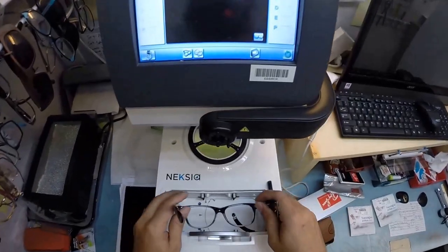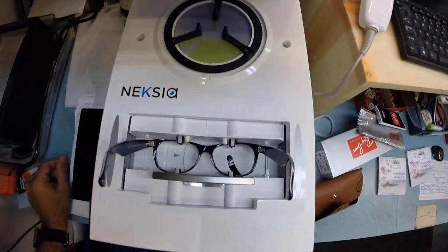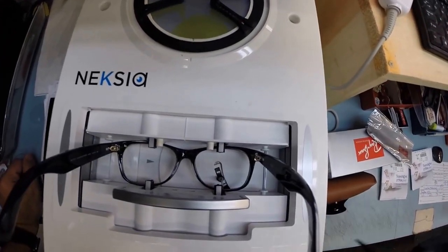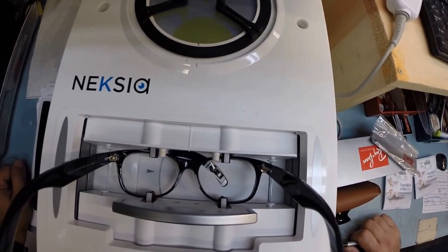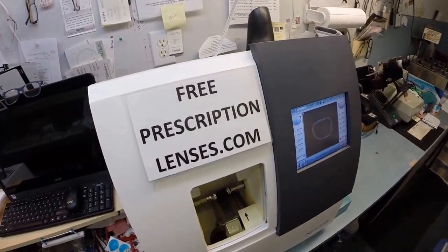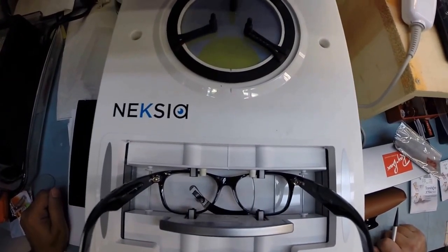Let me take your frame and put it into the tracing element of my edger. Hit that little green circle. Everybody wants to know how does the machine know what shape lens to cut? This is why: that little stylus is gonna pop up and trace the shape of the right lens before moving over and doing the same for the left.